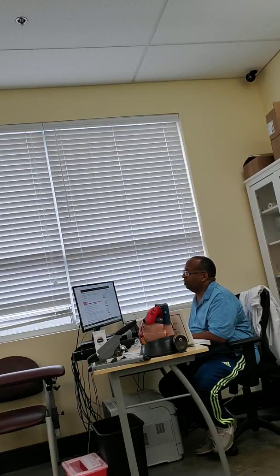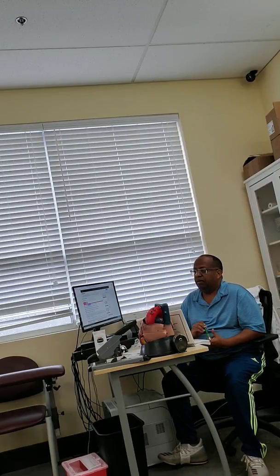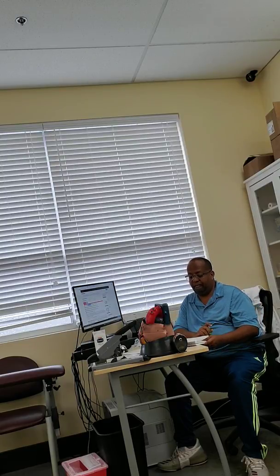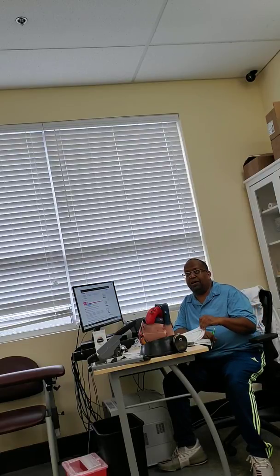So there are different calculations of QTc. This is the original Bazett's formula. The other ones are Fridericia, Framingham, Hodges formula, all this. I mean, you don't need all this, okay? If you are a doctor doing this, then yes, but for now, just know Bazett's formula. Okay. So now let's go to page 116, one heartbeat.